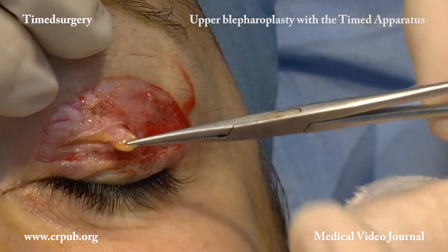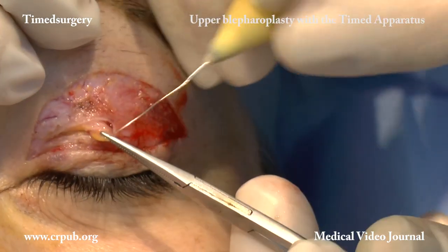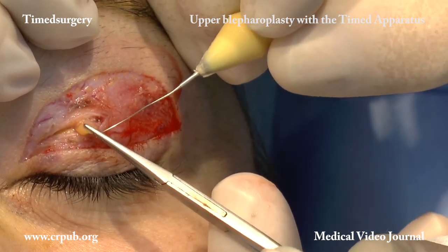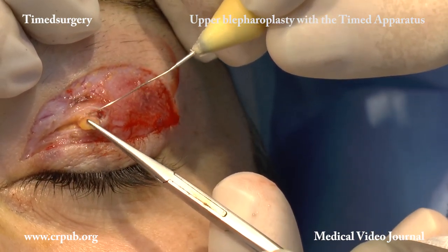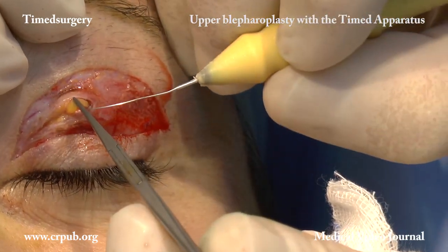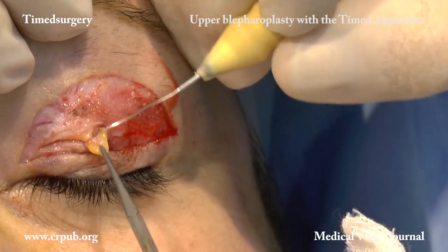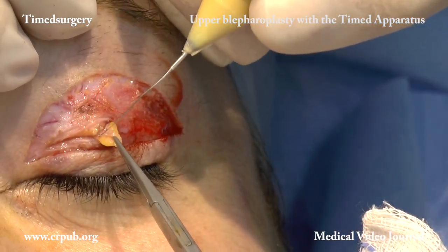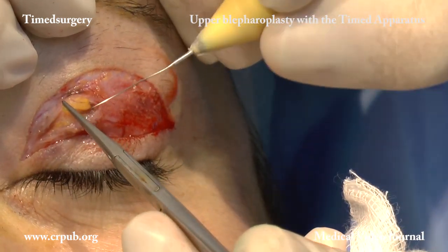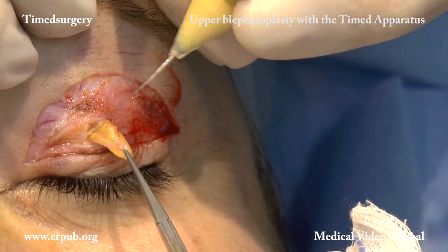Timed surgical cutting is super-selective, does not burn the tissues, and allows perfect visibility. Removing the fat from the upper eyelids enables the patient to keep the eyes open more easily. The eyelids open wider and the eyes look larger. Upper blepharoplasty is not only an aesthetic procedure — it is also functional.